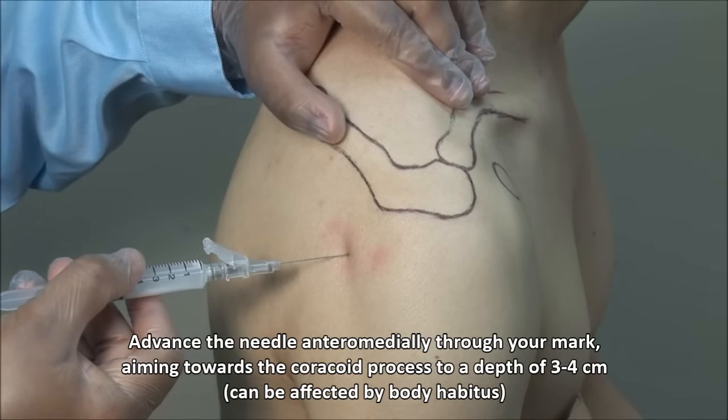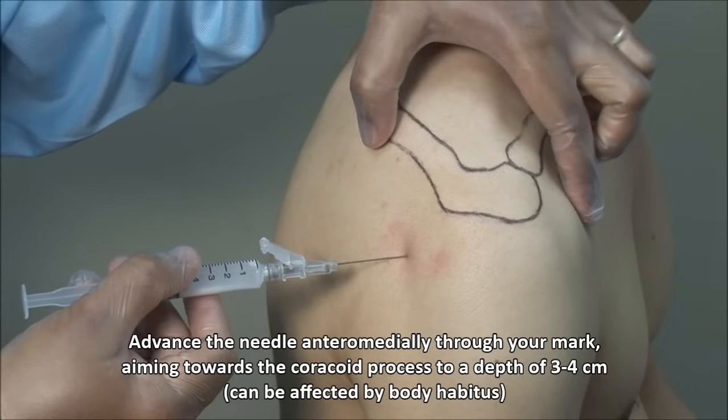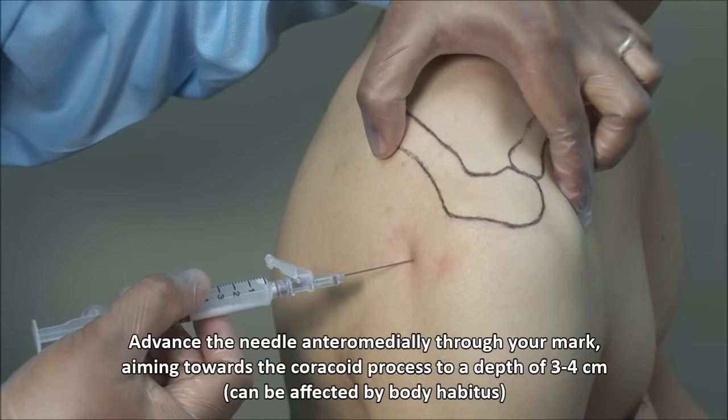Advance the needle through your mark directed anteriorly and medially, aiming for the coracoid process, to a depth of about 3 to 4 cm.